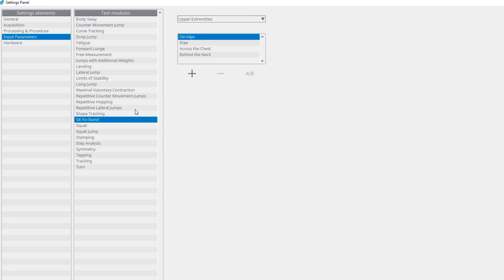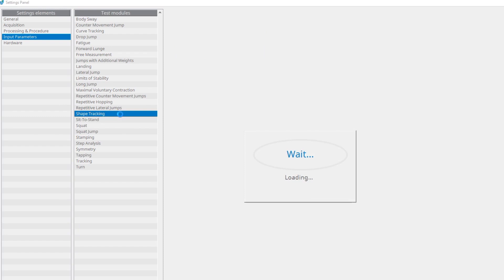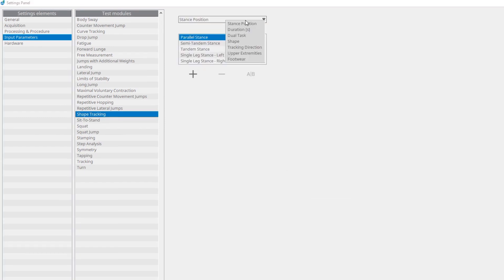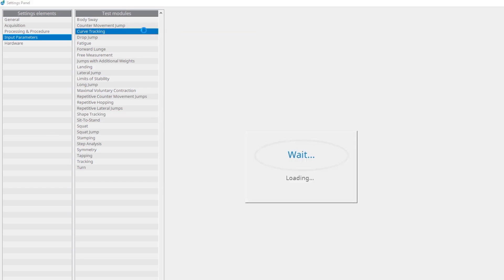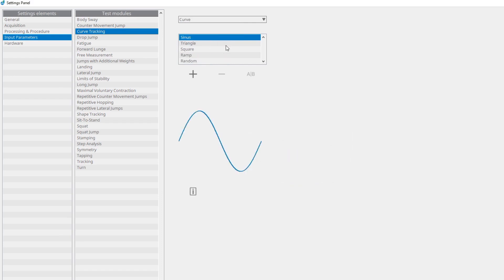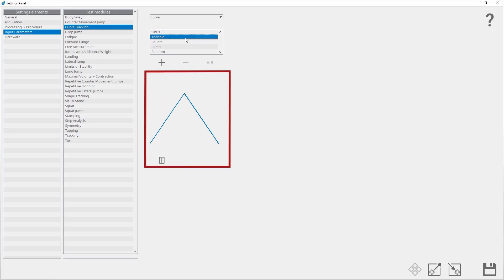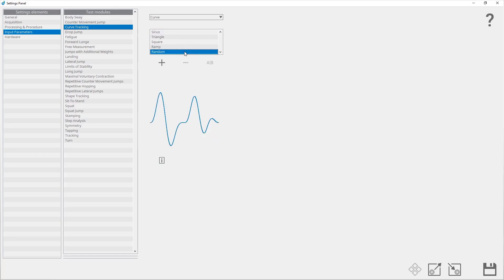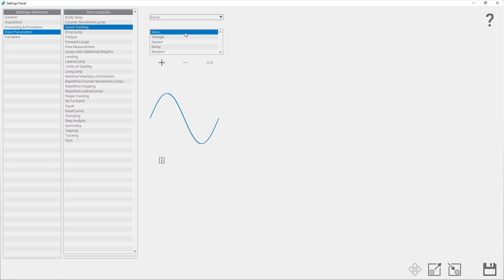There are only two exceptions. The first one is for the test module shape tracking, when you want to add a new value for the input parameter shape. Another exception is for the test module curve tracking. If you want to add a new value for the input parameter curve, there is also an image preview shown, and a detail button for viewing detailed information on the selected curve. You can add a new curve by clicking on the add button.